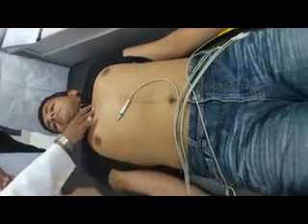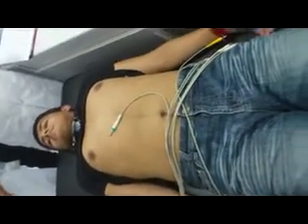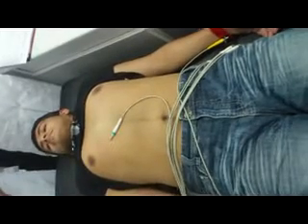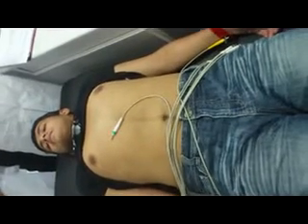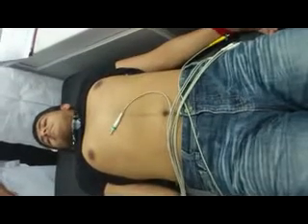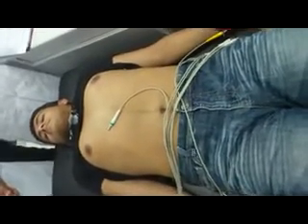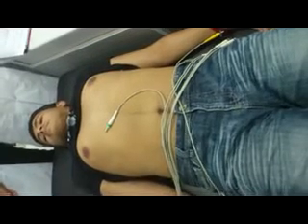How will you count the ribs? I told you from the sternal angle, from rib number 2. Okay? I'll check from here. This is the manubriosternal joint. This is the second rib. That is the sternal angle. On the two sides of the sternal angle, there is rib number 2. Below rib number 2, second space. Below this, third rib, third space. Fourth rib, fourth space. Okay? Understand? Yes.